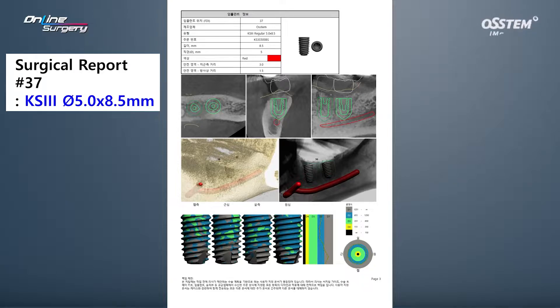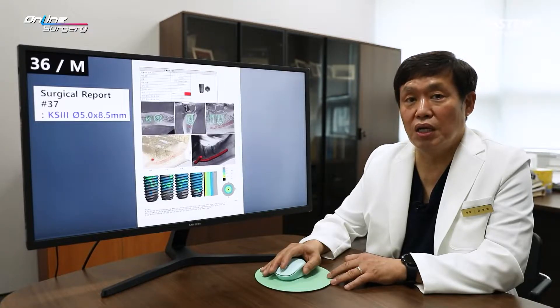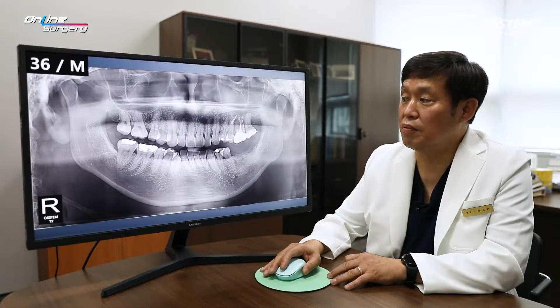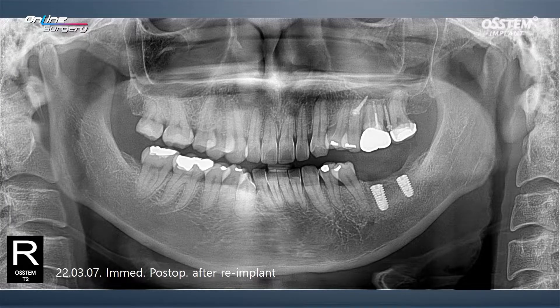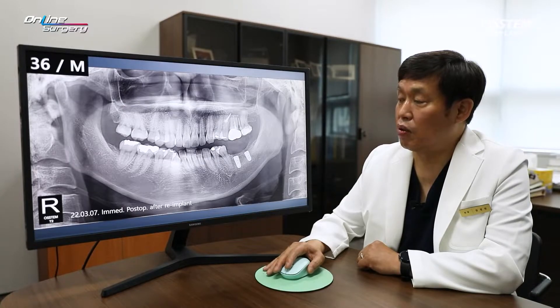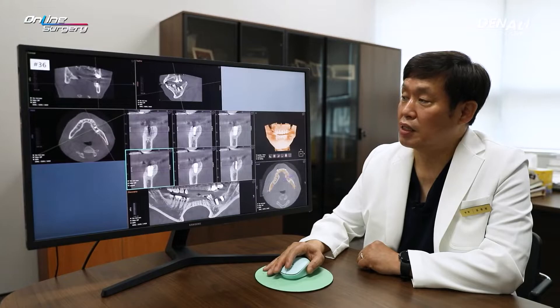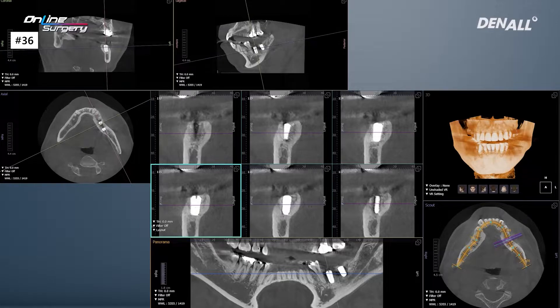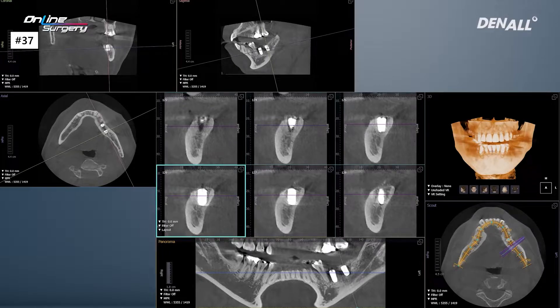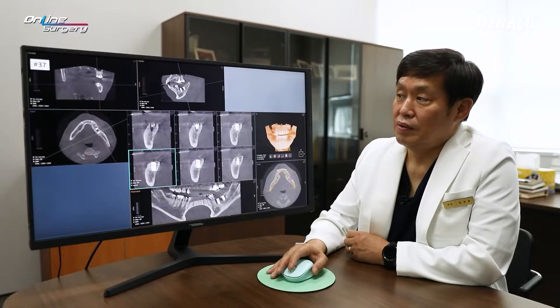One guide was used, allowing implant placement without causing nerve injury. This is the panoramic image before placement, and two implants were planned. This is after placement. For number 37, primary stability was favorable, but it was lacking in number 36, so I did not use a healing abutment but instead used a cover screw and submerged it. In the immediate post-op image, you can see the implant placed nicely in number 36 with graft material being maintained. Number 37 was placed as planned.